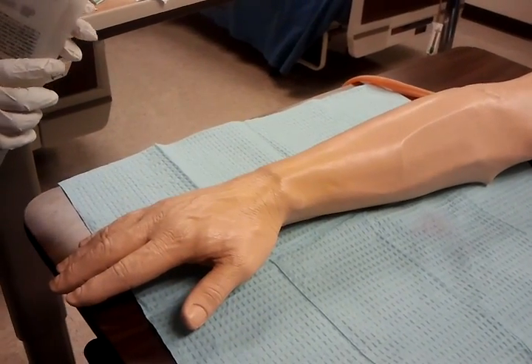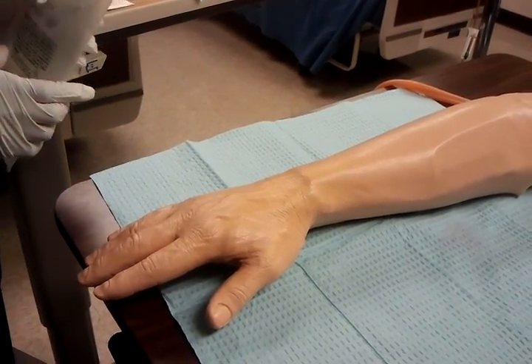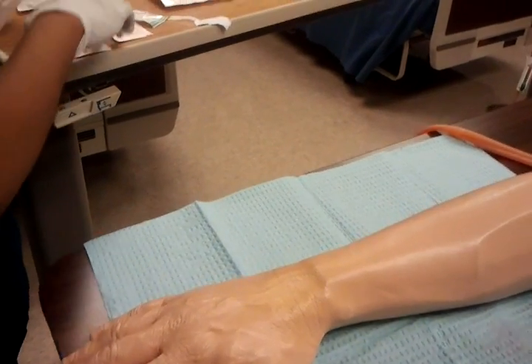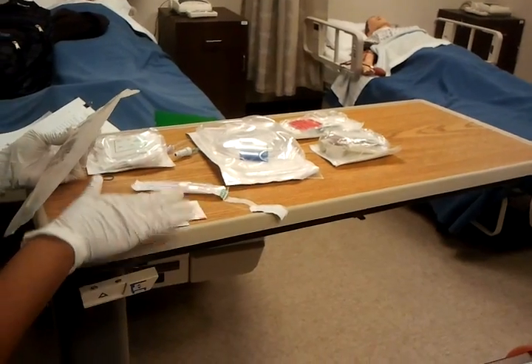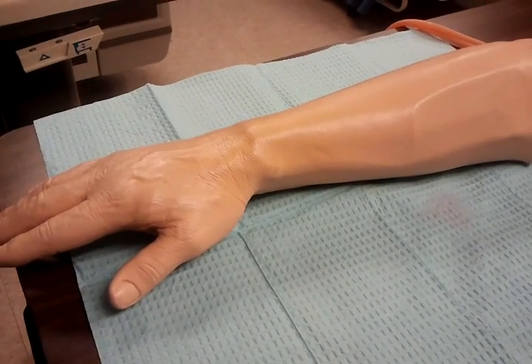Okay, the next step is to gather all your appropriate equipment. Alcohol swabs.